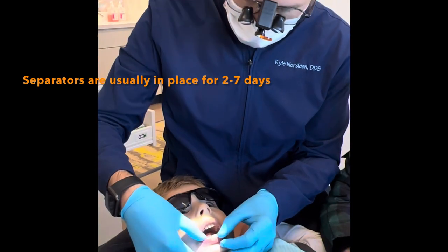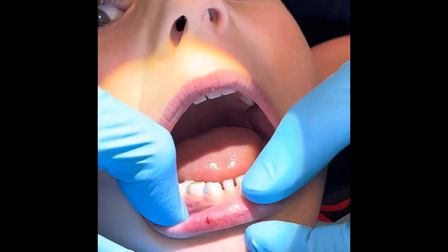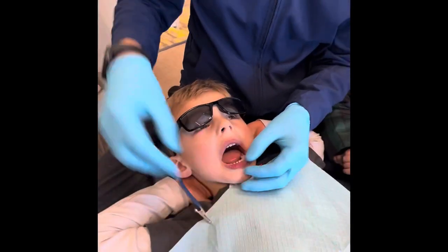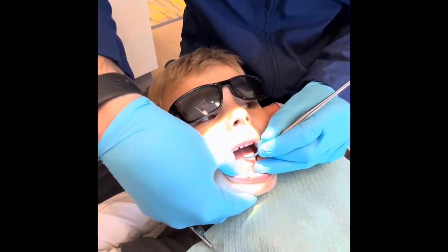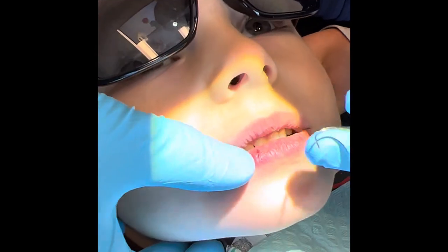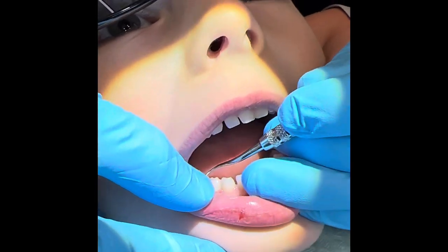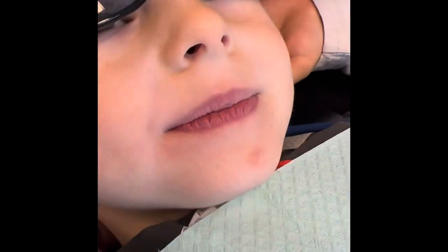Good job, you did it! Okay, so go ahead and open really big. So we have our rubber bands in there — it's been two days and James did a good job keeping them in. Now we're gonna take those rubber bands out. I'm just gonna use my little rubber band getter. Open big — we got one out — and open really big again. Good job!